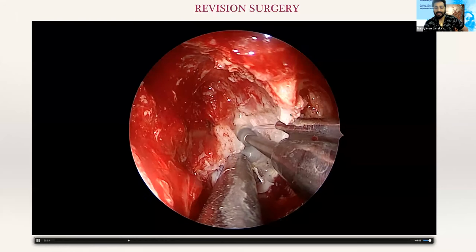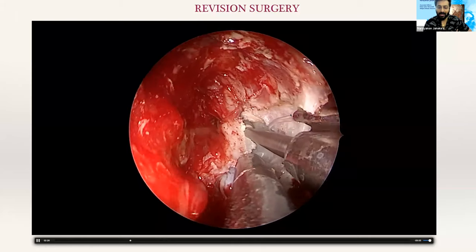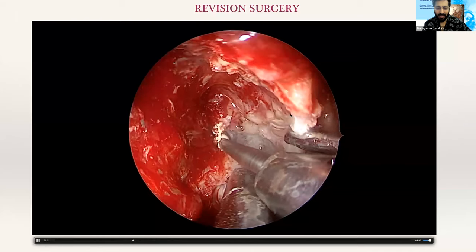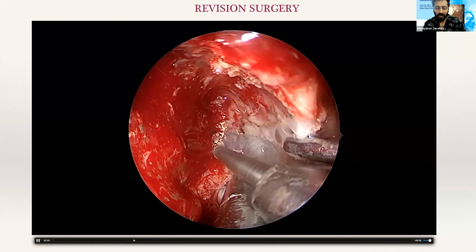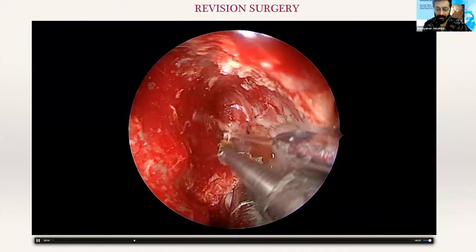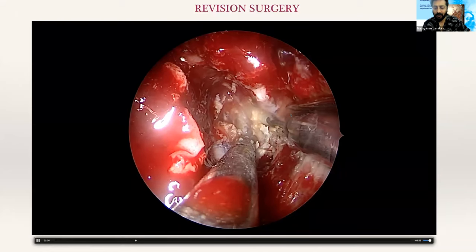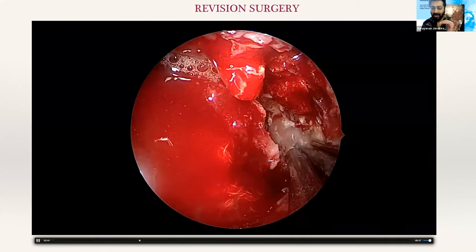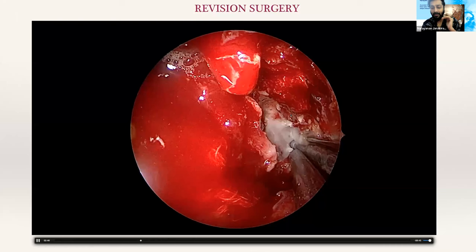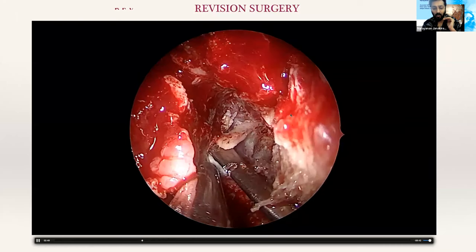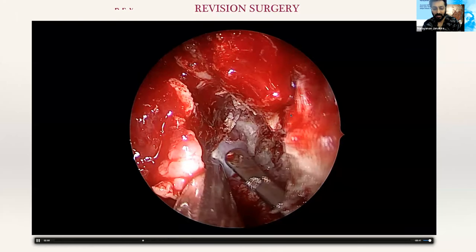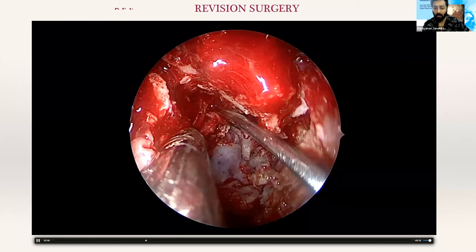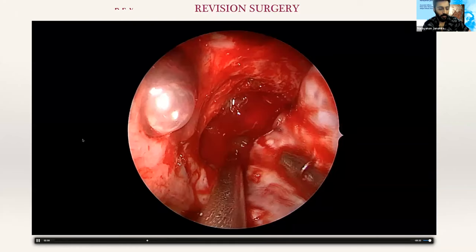I need to remove that wall to get at the tumor prolapsing into the cheek. This is what is called planning — you have to plan that. It cannot be done with an MRI. I don't think MRI is a meaningful investigation for JNA especially for the extracranial part. Of course when going intracranial that's a totally different ball game. Now I'm removing the junction of the posterior and anterolateral wall of the maxilla.